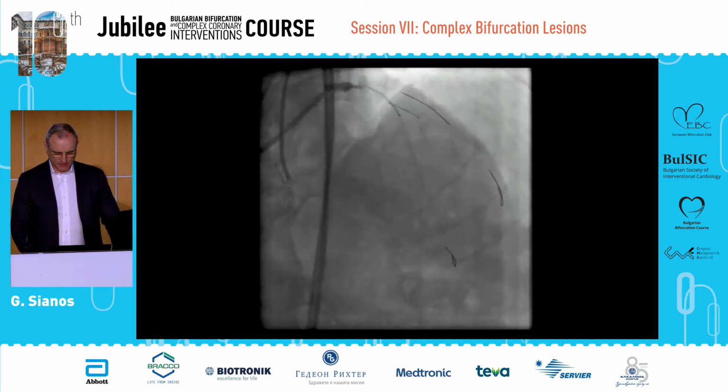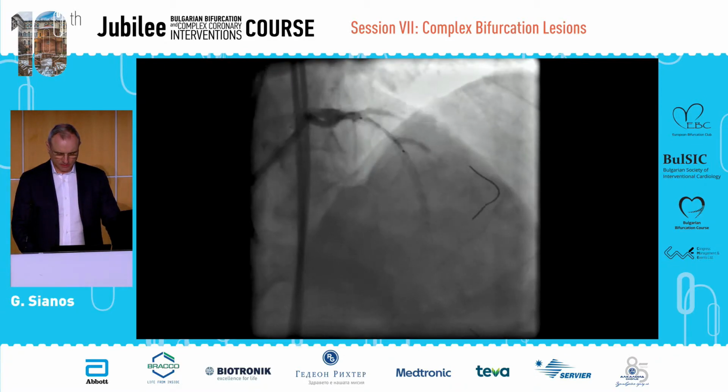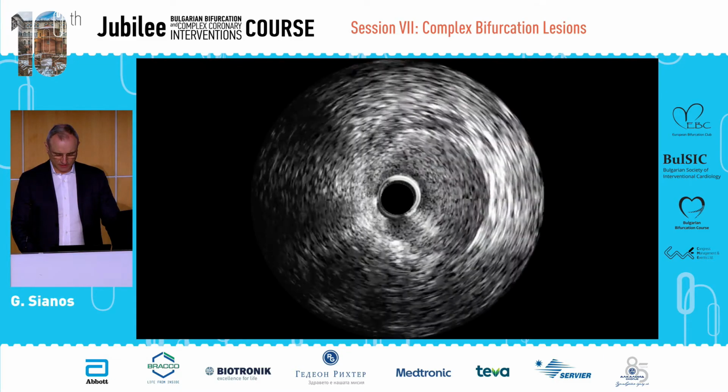What happened here, one stent is placed distally. Again, mini crush technique. When you're having these true bifurcation CTO lesions, actually it's a must. Bifurcation stenting is the used or preferable technique. You don't have many options over there because it's very difficult to rescue such branches otherwise. You see the stent is placed. It's mini crushed, final kissing.